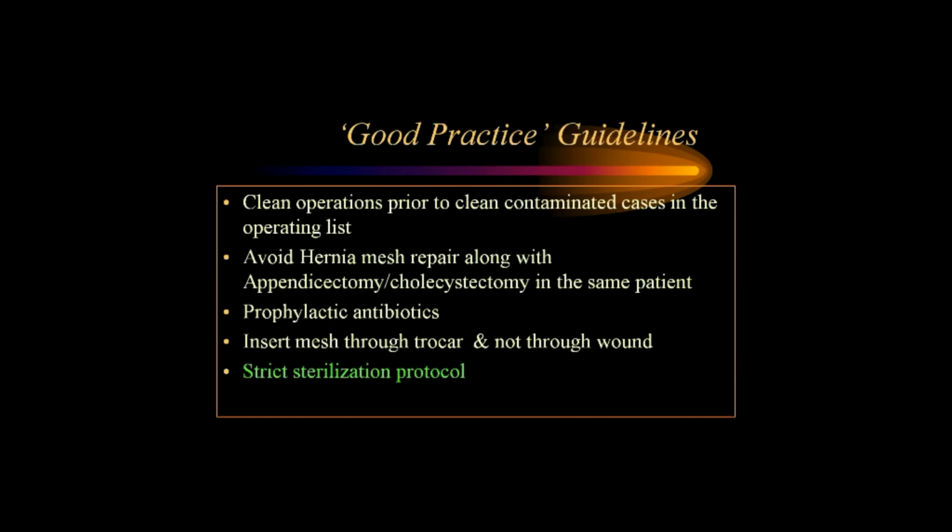Prophylactic antibiotics are necessary to minimize the wound infection, especially when we put some mesh in patients with the hernia. And when we take the mesh inside the patient, it should be through the trocar, not through the wound. And also we should have strict sterilization protocol.